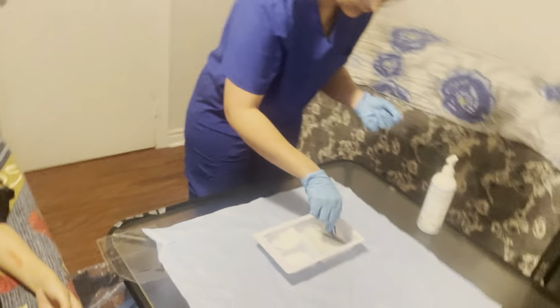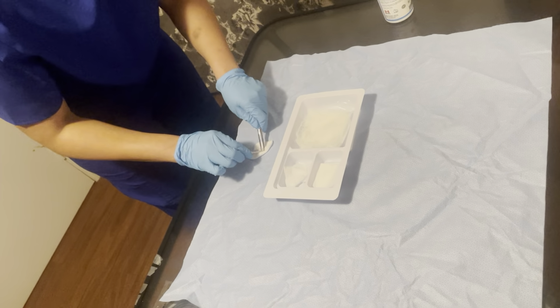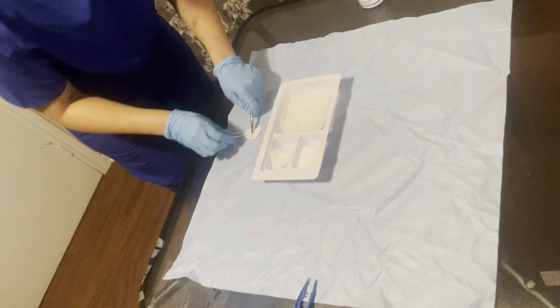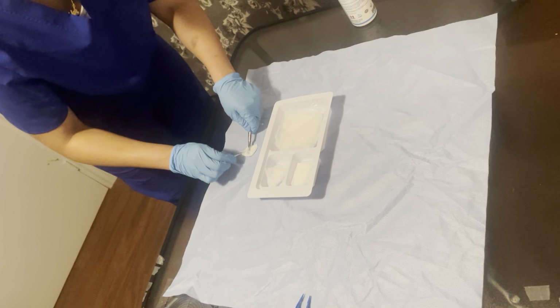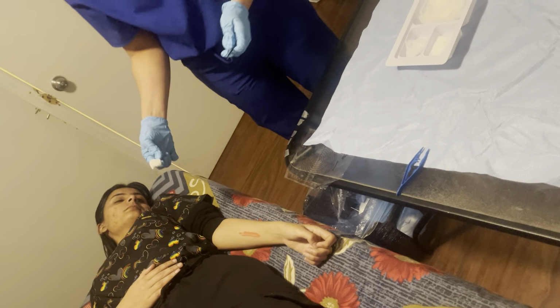So these gauze pieces are already soaked in normal saline. So we'll be cleaning the wound with the gauzes soaked in normal saline by making the dumplings, removing the excess of normal saline. So firstly, I'll go from head to toe, from least contaminated area to the most contaminated area and the area that is far away from me in a single stroke, and discarding it off.